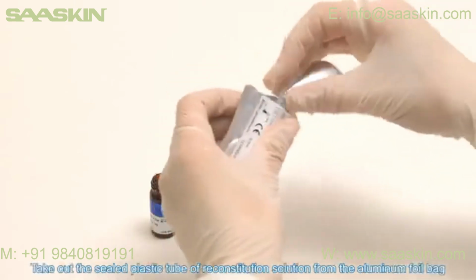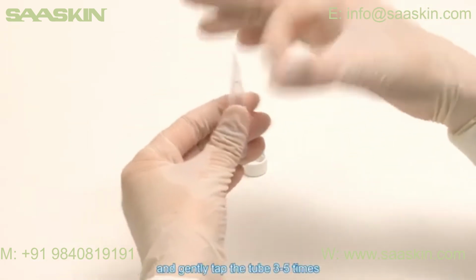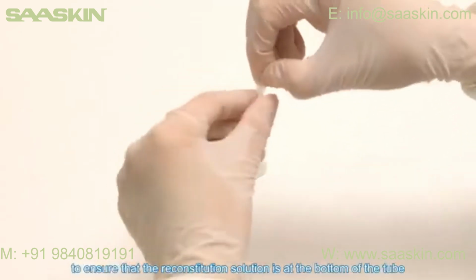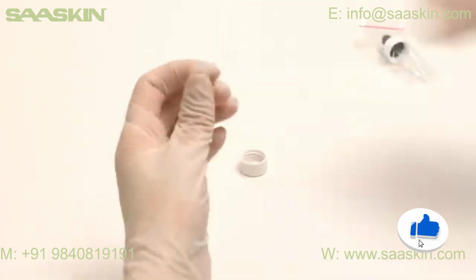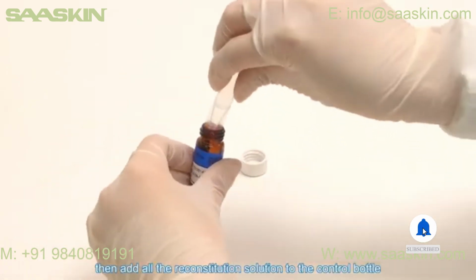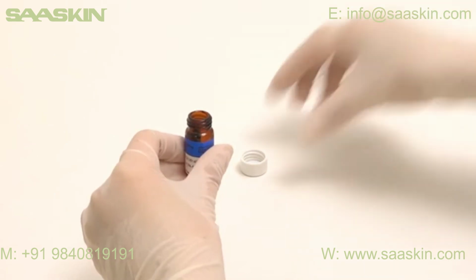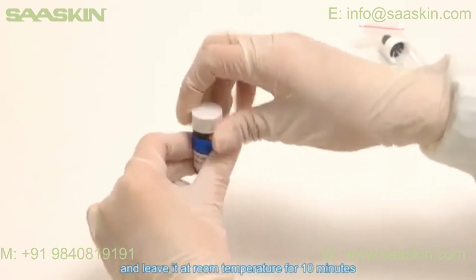Take out the sealed plastic tube of reconstitution solution from the aluminum foil bag and gently tap the tube 3 to 5 times to ensure that the reconstitution solution is at the bottom of the tube. Unscrew the front seal of the tube. Then add all the reconstitution solution to the control bottle. Tighten the cap of the control bottle and leave it at room temperature for 10 minutes.